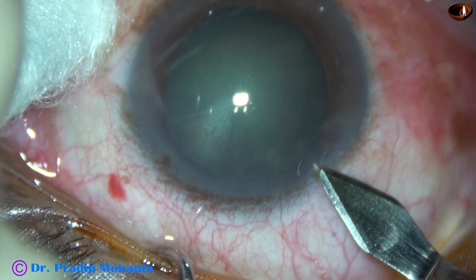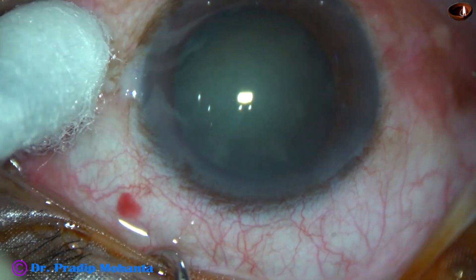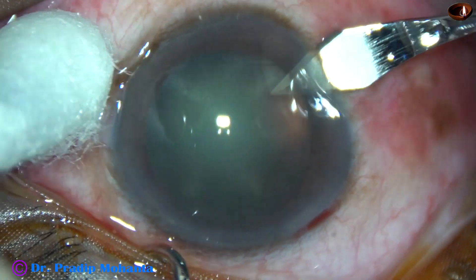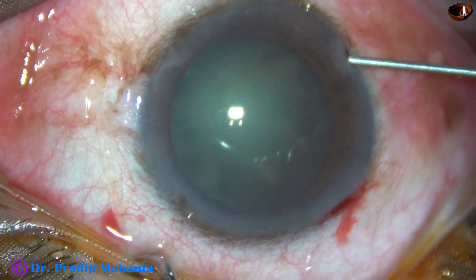This is the main incision with a 2.8 millimeter steel keratome. This is a side port on the right side of the main incision, and now an air bubble is injected.